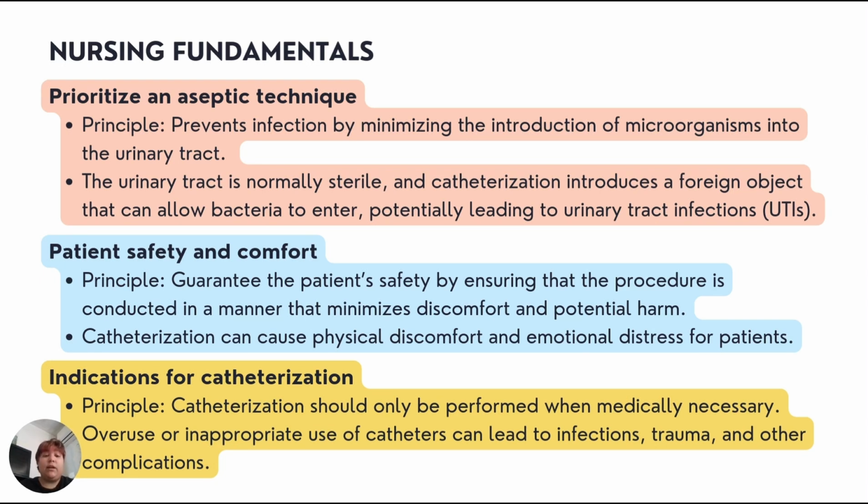Patient safety and comfort. The principle here is that we guarantee the patient's safety by ensuring that the procedure is conducted in a manner that minimizes discomfort and potential harm. Catheterization can cause physical discomfort and emotional distress for patients.